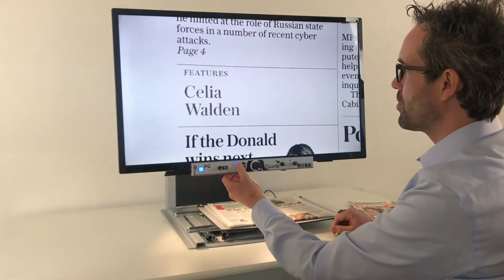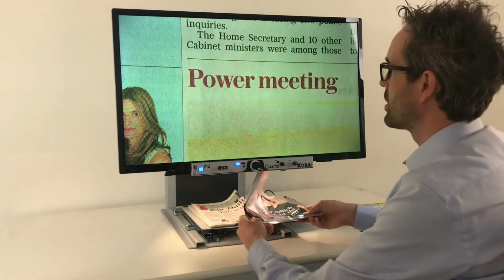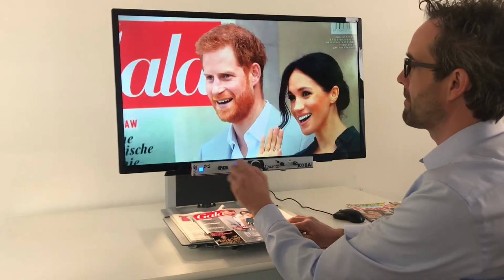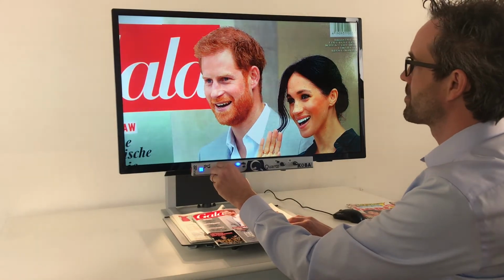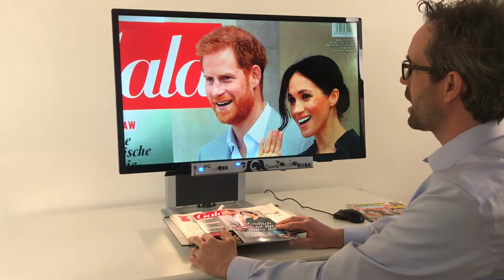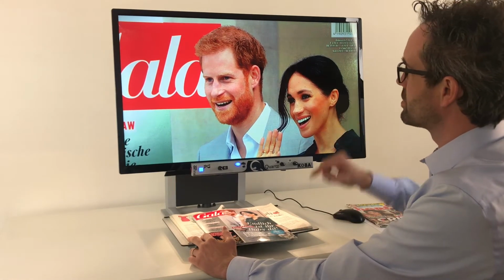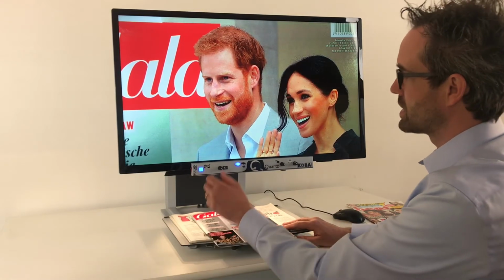If you are in photo mode, then this is for zoom out, minimum, zoom in. Here you can change brightness, more brightness, less brightness. Most of the time it's better to make it a bit darker so you can see the faces better and the contrast is better. But that's up to the user.